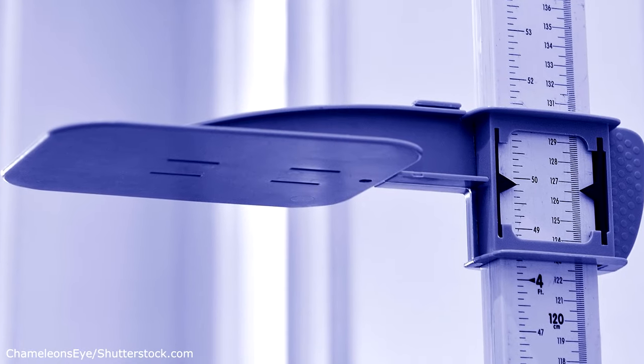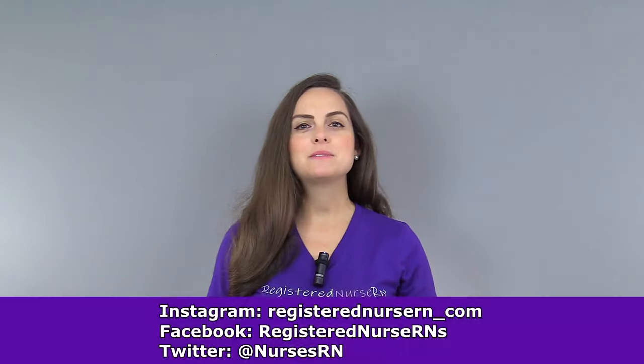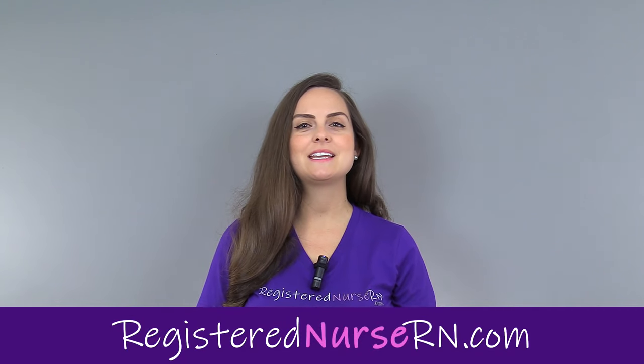You can also use another method of measuring length by using a medical device called a stadiometer. So that wraps up this demonstration on how to measure an infant's length. Be sure to check out the other videos in this series.